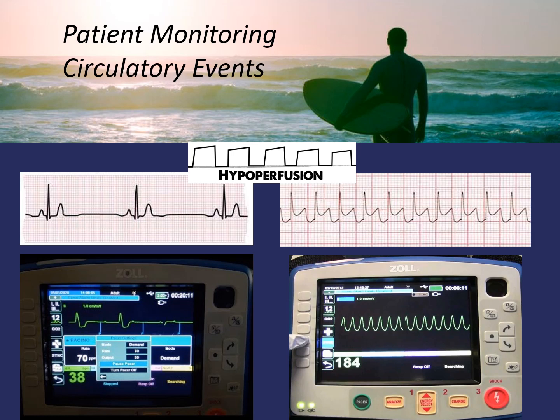So trending gives us continual feedback on whether the patient is improving or not. Cardiac events, pacing, tachycardias, myocardial infarctions, we can assess perfusion status with capnography. This is a continuous monitoring of perfusion status that is not inhibited by movement, whereas our blood pressures, performing 12-lead, pulse checks, etc., are only snapshots of time. Cardiac perfusion changes will affect end-tidal CO2 levels, assuming circulatory compromise is the only etiology at work.